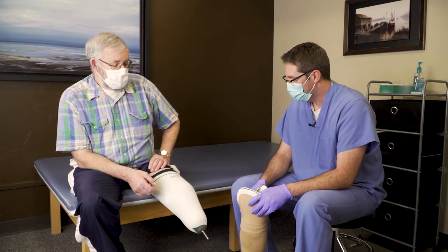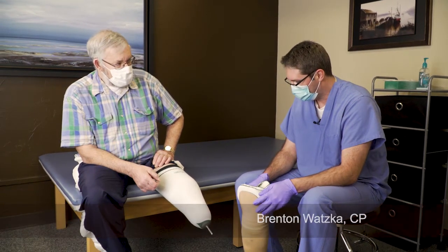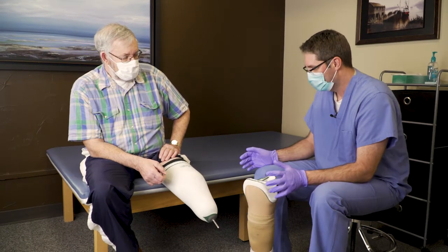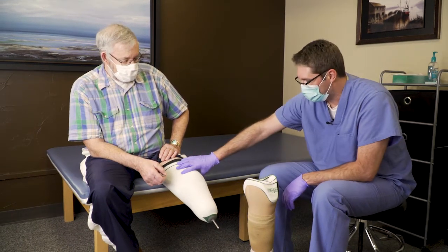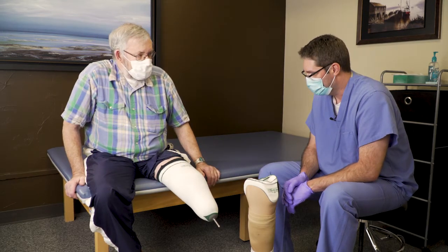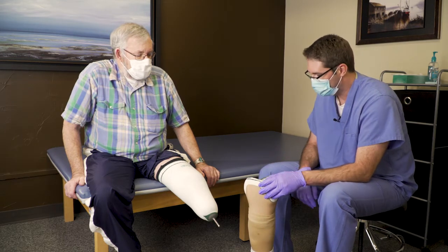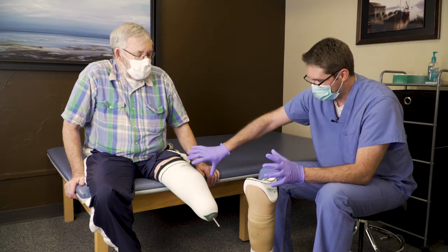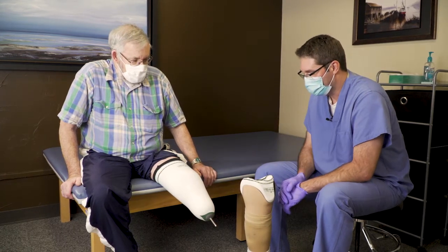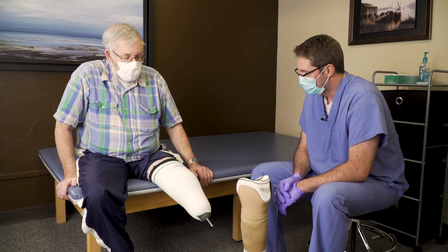Today we're here with Jim. He's agreed to come in and explain his prosthesis that he wears and the different aspects of it. Recently he had some complications where there was a fracture in his femur, so he was off his leg for a while, and therefore we added a little extra cushion inside of his pin system to allow for extra cushion around the area where the fracture was, so we weren't adding excessive pressure to an area that was already sore.